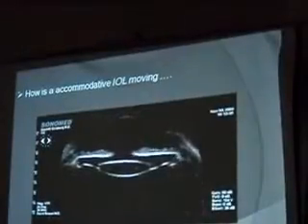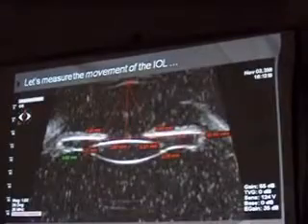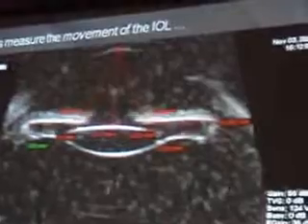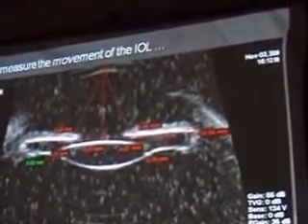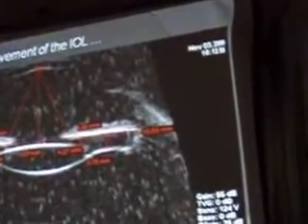Let's get back to this gentleman that I really can't explain why this patient is reading. And let's do some measurements. I won't go into the measurements, but look at the maximum and minimum accommodation and disaccommodation of this eye. Sorry about the background noise. It was snowing that day. And all the measurements explain that there are clearly changes inside the eye. It's probably not justified based on what we have known, what the manufacturer pretends. It's not clearly justifying the diopter change, positive diopter change for near vision.